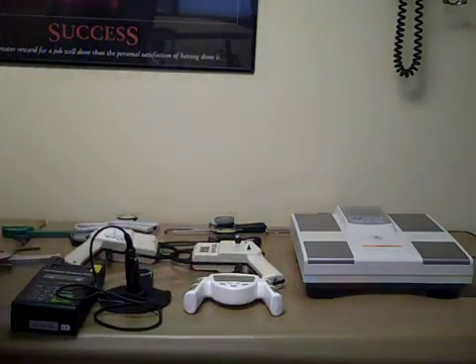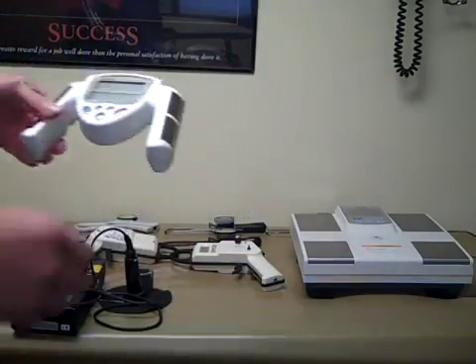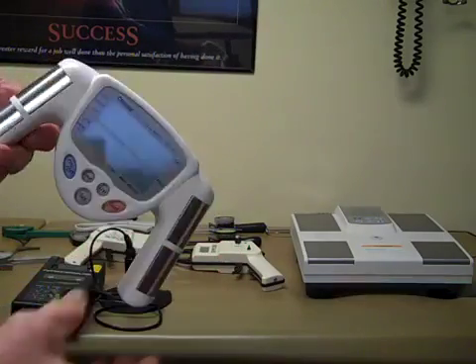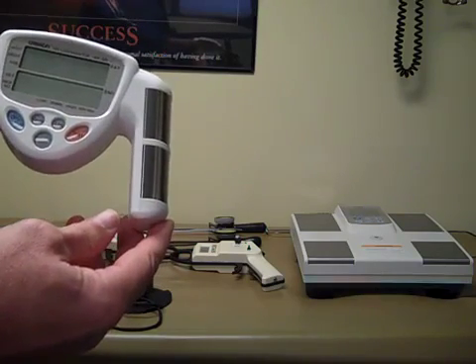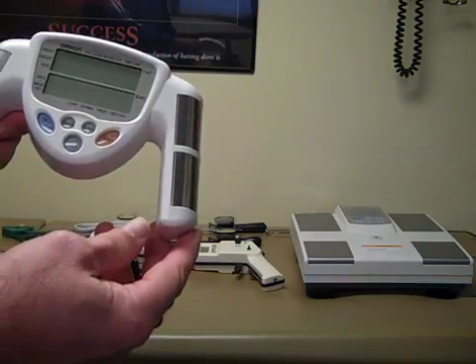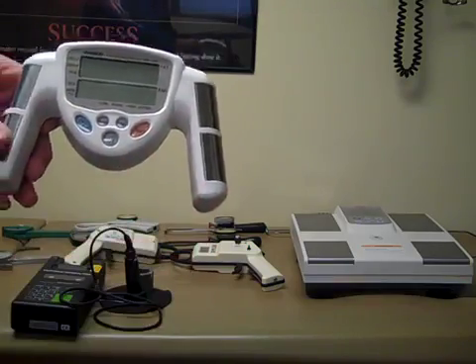These have a calibration block that you would do your measurements with just to ensure that they're accurate. This is an electrical impedance unit made by Omron where they're held in the hand, and you would select some variables like your sex, height, and weight. This will compute out BMI and also your electrical impedance. One issue is you need to put in whether you are an athlete or not, and that can change the number significantly.